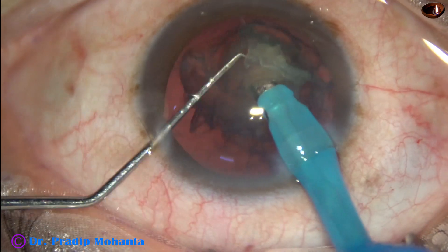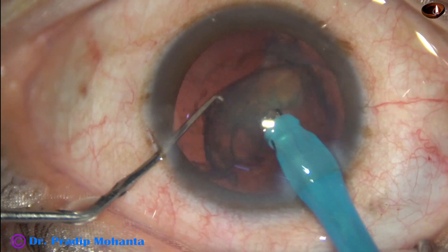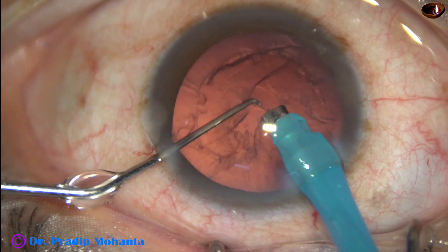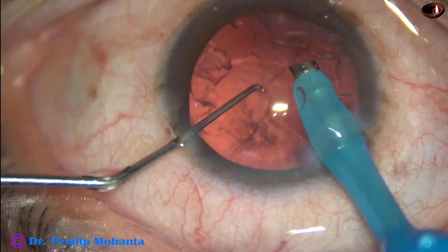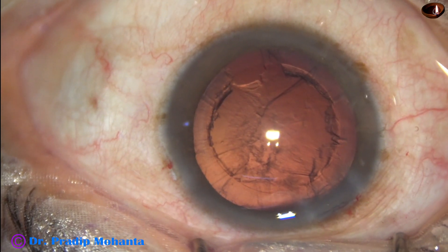This is the last nuclear piece. At this time the vacuum is 350 and flow rate 35. Nucleus is managed. Now cortical cleanup is to be done.